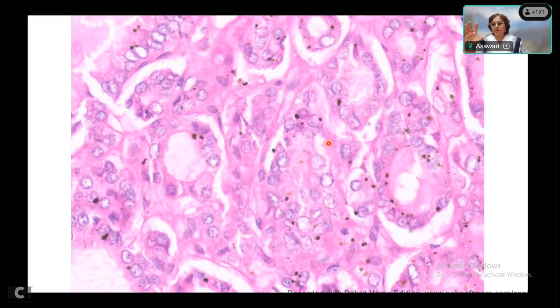You saw an encapsulated neoplasm, right? Yes, ma'am. So an encapsulated neoplasm. There is capsular invasion seen. Okay. What was the pattern? We found there's this encapsulated neoplasm. What kind of pattern is the tumor showing? What kind of patterns do you know in tumors?